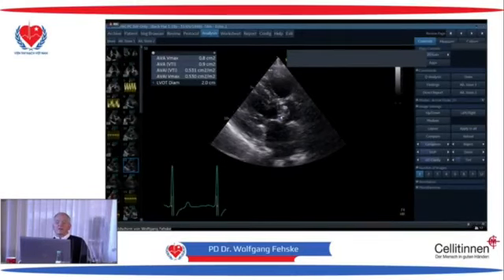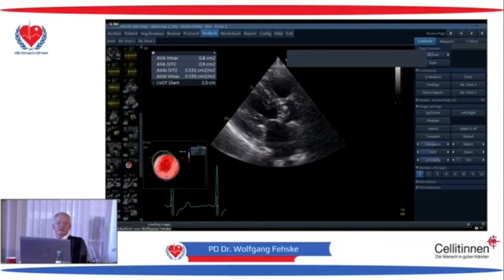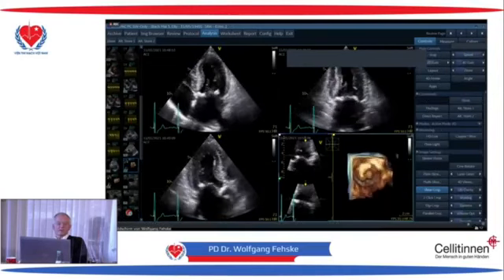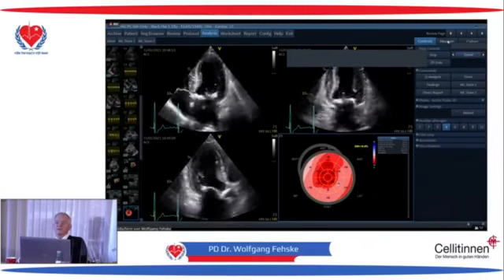And I will show it to you in a second, because I knew yesterday that I had the seminar today, so Bach-Mai conference. So I asked the patient if I could do a transesophageal echo with her. So this is what I will show to you. She had a good ventricle. Let's just look for one thing which is interesting in this patient too.